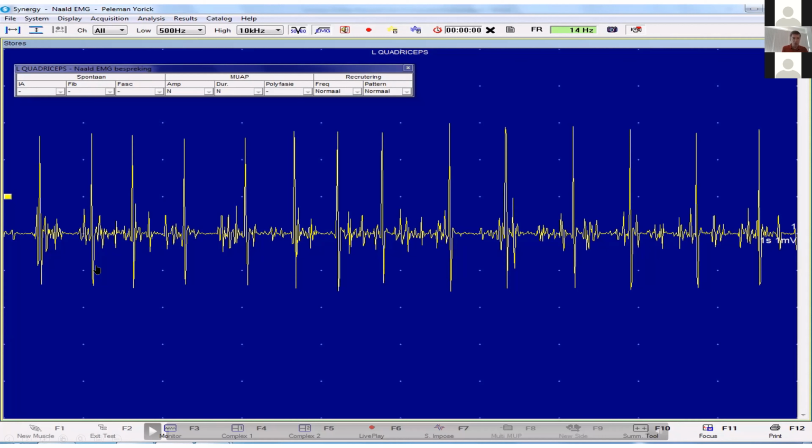As well, in this snapshot at the start, we see this motor unit firing 1, 2, 3, 4, 5, 6, 7, 8, 9, 10, 11, 12, 13, 14 times. So remember, in our first sample, at 14 hertz we already had a second and a third motor unit firing. Here, of course, there are small activities over here, but we don't see a clear, sharp motor unit firing in the neighborhood of this first one.